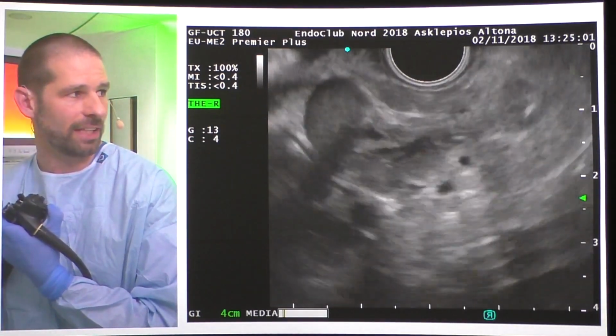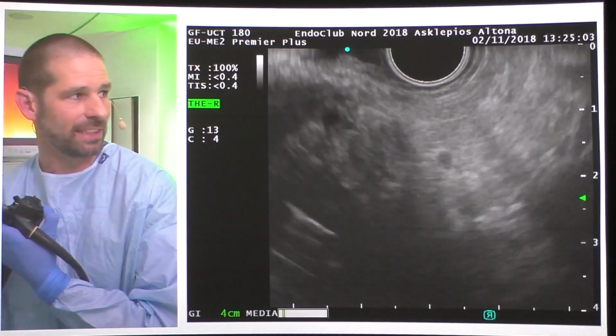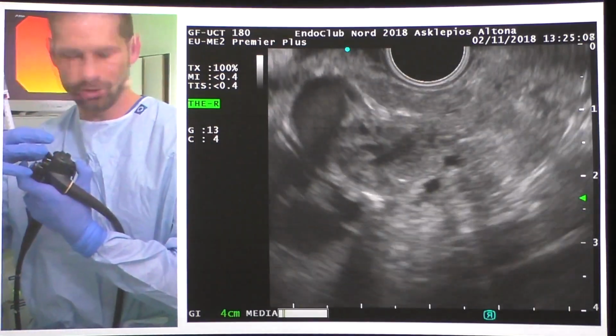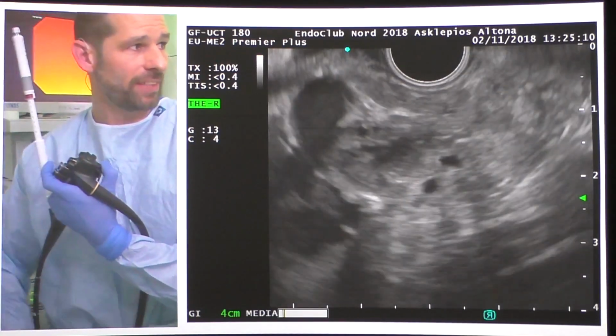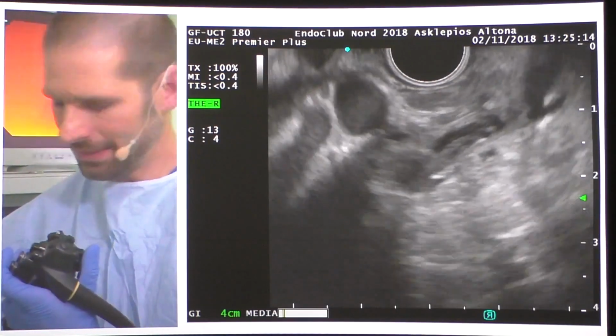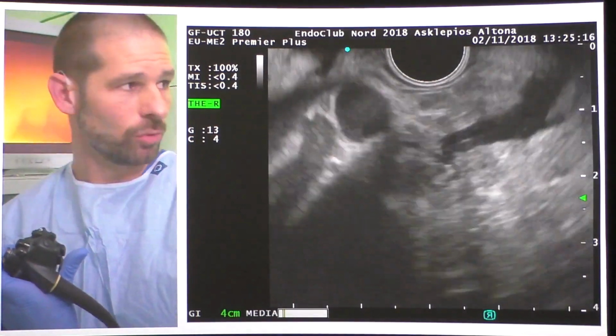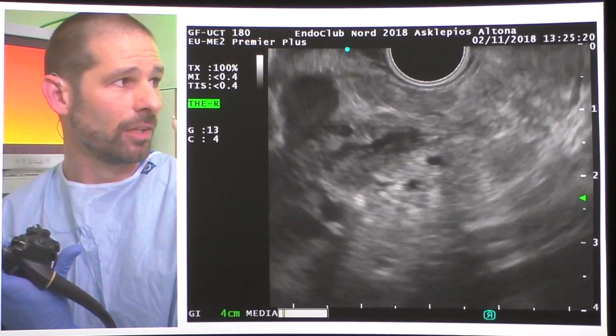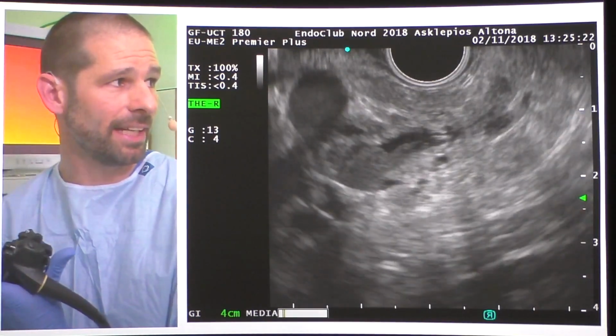The fish mouth papilla was only seen once and never again. So the question is whether with this short moment we can be relatively sure. Now here I do not want to puncture the vena lienalis, and this is an FNB needle.